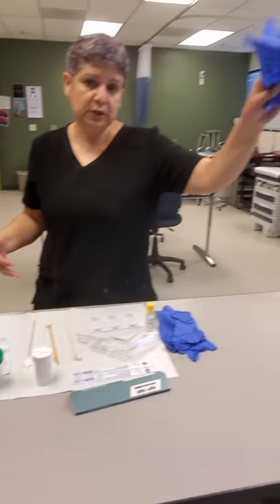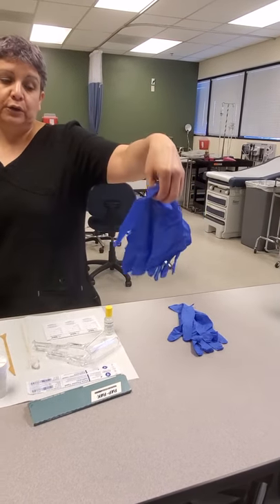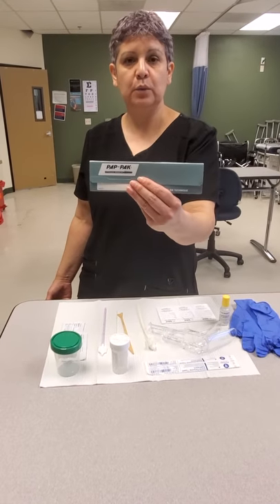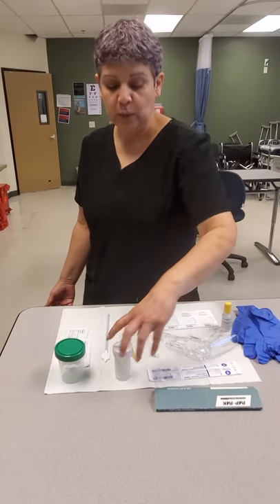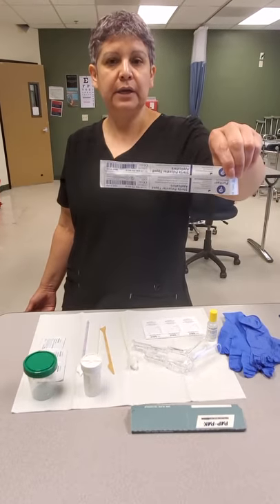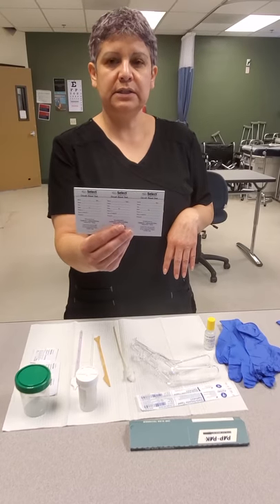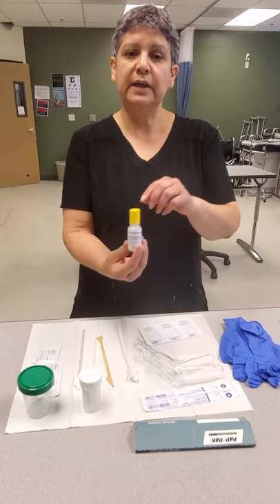We have two gloves here — one set is for the MA — and three gloves for the provider. We have an old pap kit which some providers still use, and a new thin prep which newer doctors will be using for pap smears. We have a sterile tip applicator and a vaginal speculum. We have three occult tests — occult tests are for hidden blood in the stool — and we have the developer.